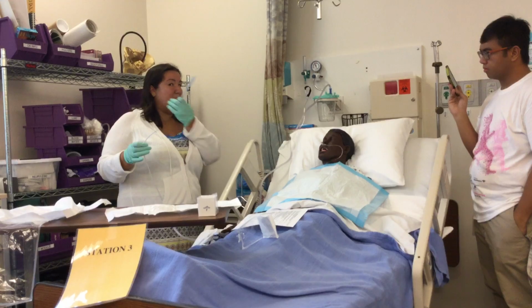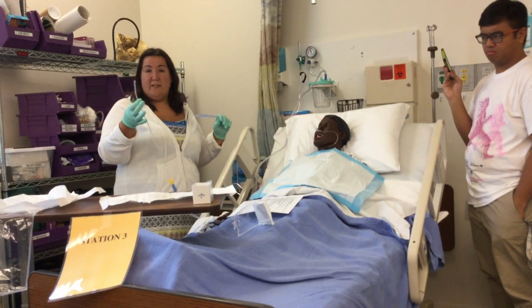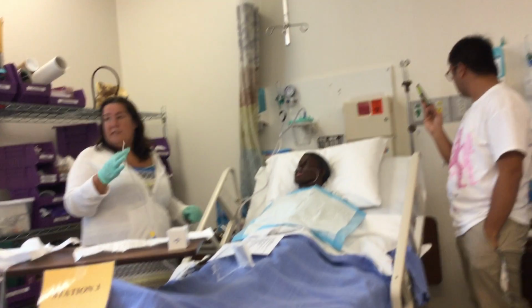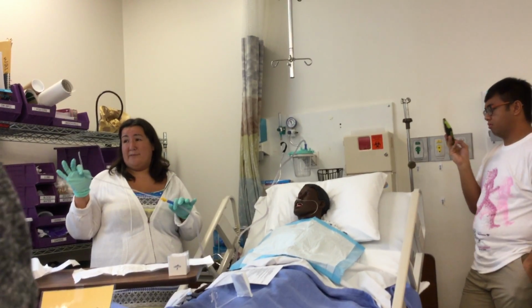When you do this, you'll see all the stuff pocketed in their mouth if they're impaired and not getting rid of it. You'll see it all in the back of their mouth. So you can use this if they're kind of comatose and not moving around much, then you can go ahead and do their mouth. But if you're afraid they're going to bite down, I wouldn't use this.